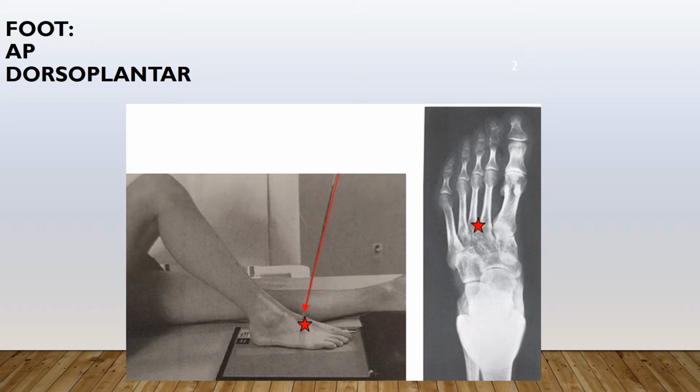Now, if I was in a podiatry office, their x-ray tube is actually flipped. Now, in saying that, that means that in a podiatrist's office, the cathode side of the tube is going to be toward the rear foot, and the anode side of the tube is going to be toward the phalanges.